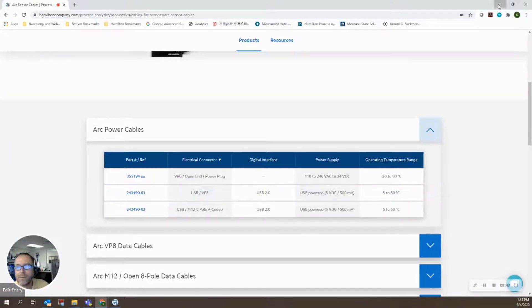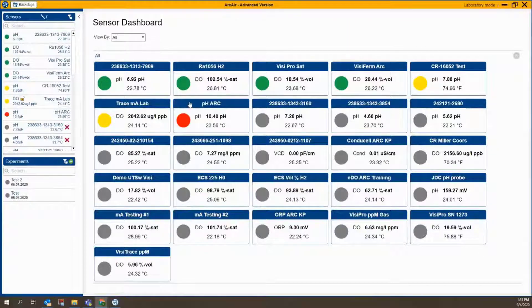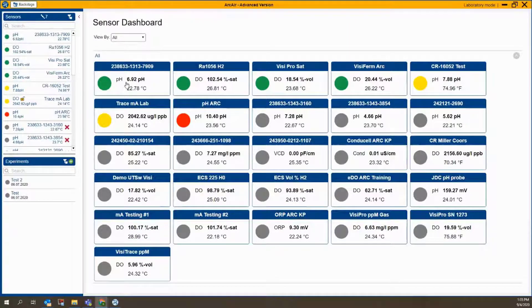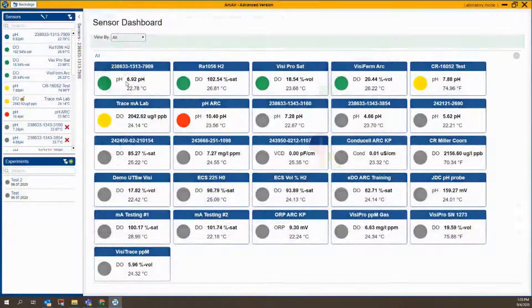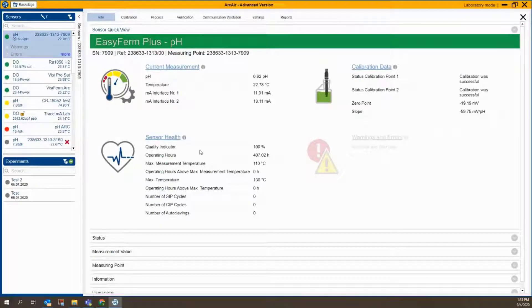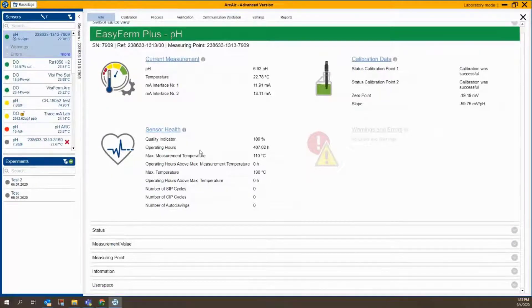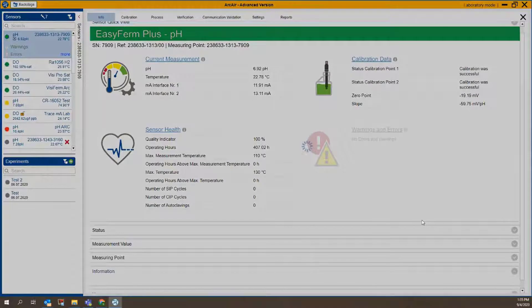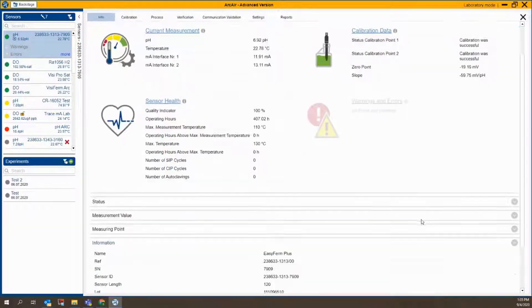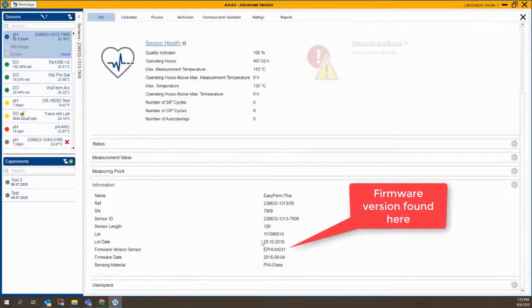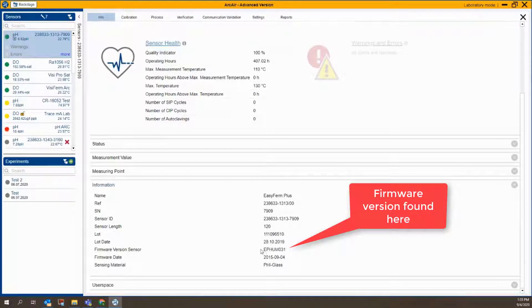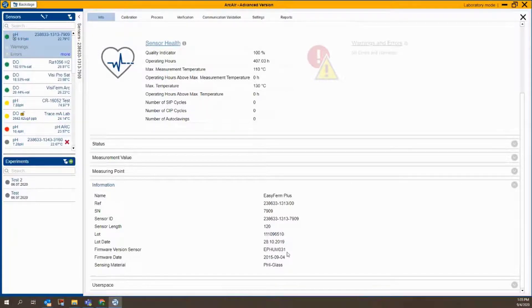So let's go into ARC Air and take a look at how this is done. I've got a sensor right here that I'll click on, and it's an EasyFirm Plus ARC sensor. If you scroll down here at the quick view screen, you can go down and take a look at the information tab, and this will tell you the firmware version. So this is EPHUM031.